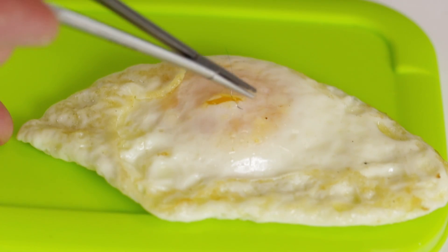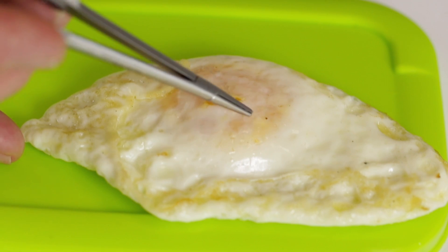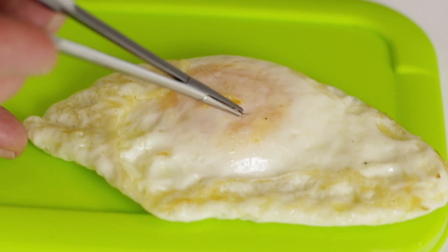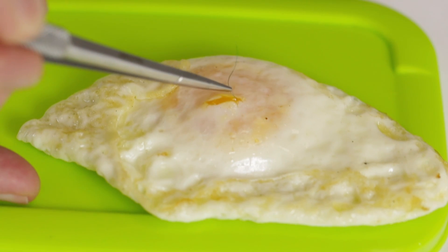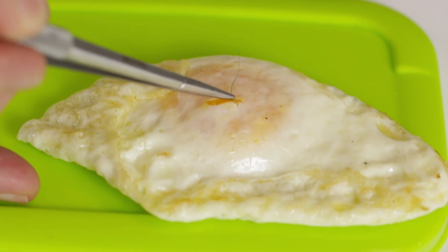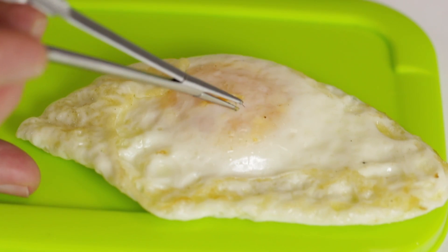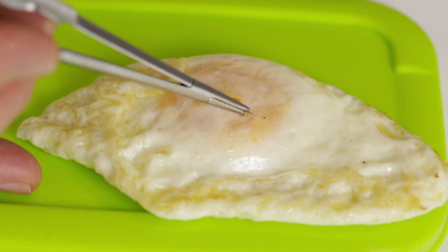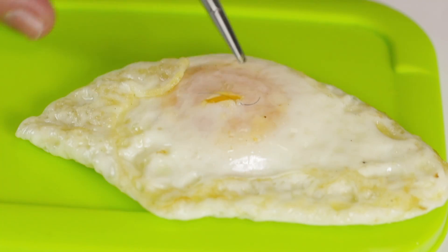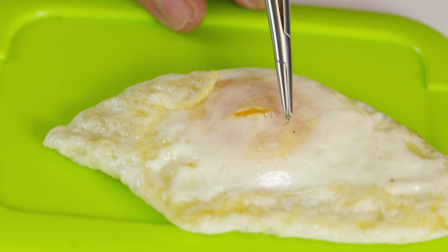It's funny — I'm just thinking to myself as I'm concentrating, picking this needle up carefully without tearing the tissue. I don't appear to be able to complete a sentence or talk. And I just tore it there for a moment.